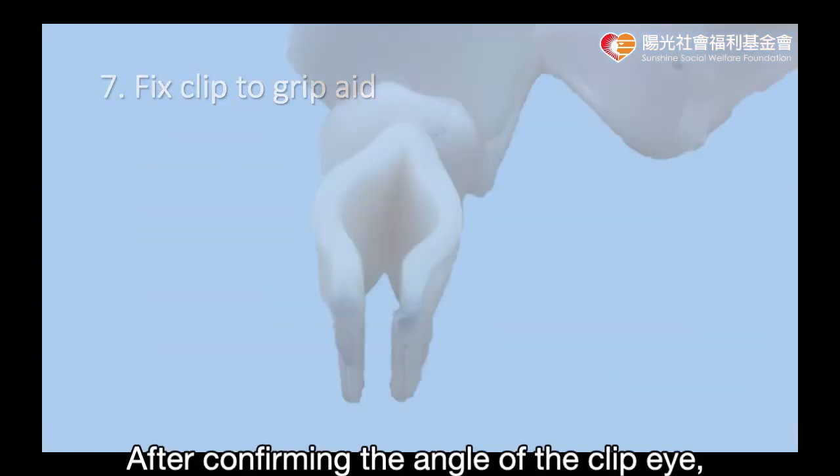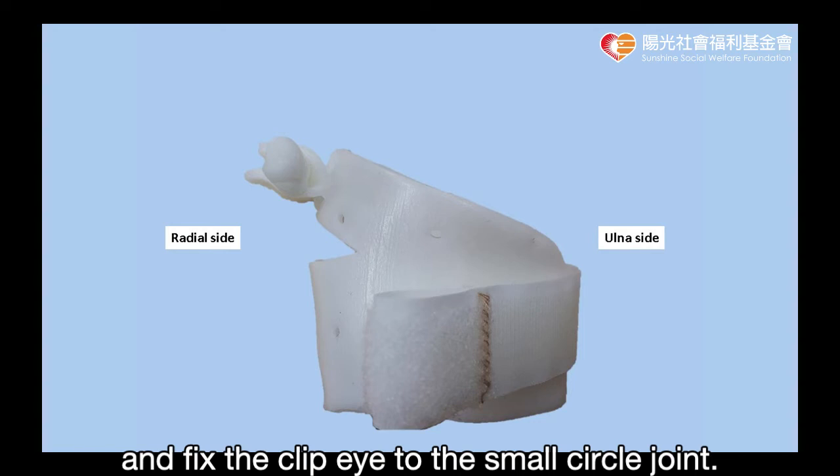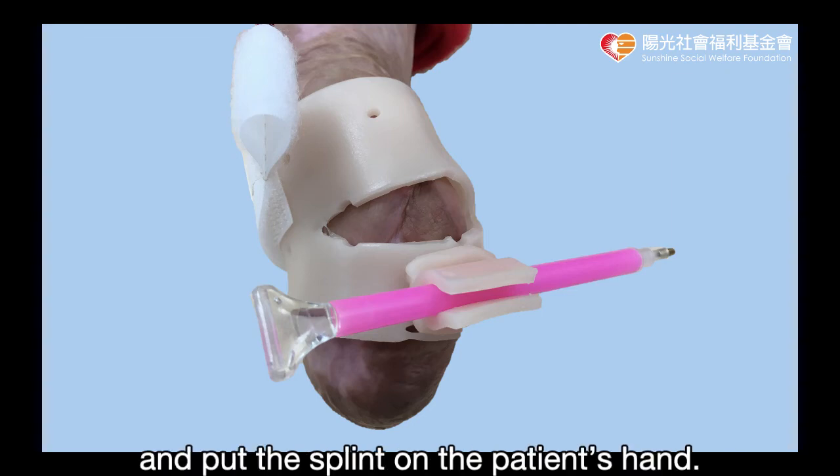After confirming the angle of the clip, fix the small circle joint to the body of the splint and fix the clip to the small circle joint. Place a tool like a pen inside the clip and put the splint on the patient's hand.